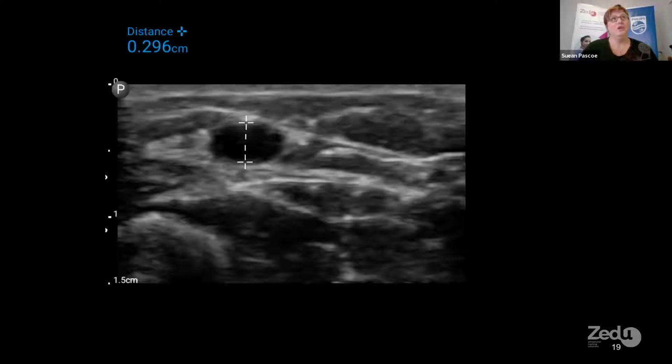Now, when you're measuring the diameter of the vessel, you've just got to have a really light feather touch so that you're not accidentally compressing it. I guess try to measure this without the tourniquet on because it's the natural state, but you can certainly put the tourniquet on to help dilate it to get access and make that target bigger once you get going.